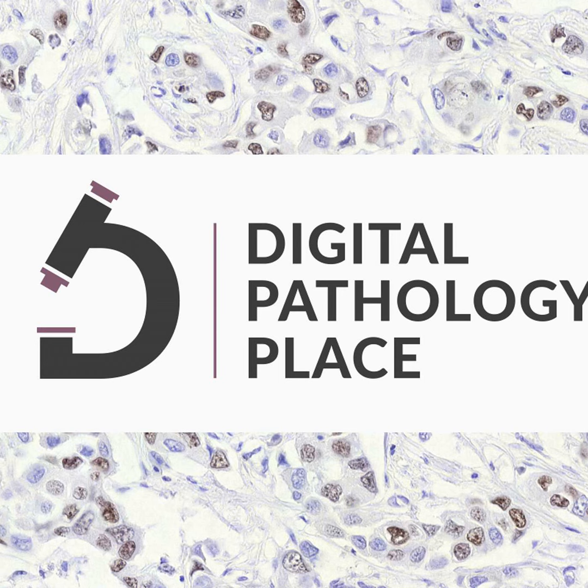Exactly. So the thing is that with the images that we're working with in computational pathology, putting an entire image naively into a deep convolutional neural network is impossible. Even if you had the fastest supercomputer on the planet, it would still be completely infeasible to do that.